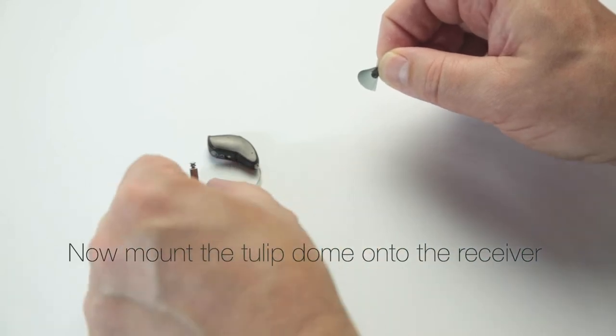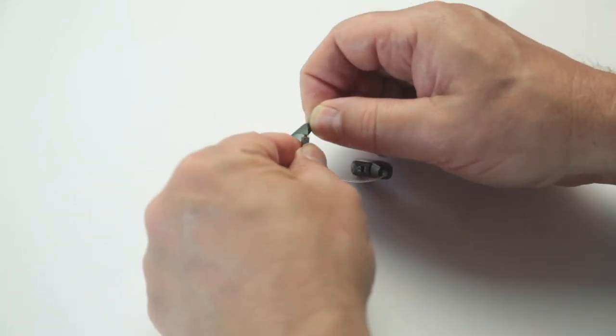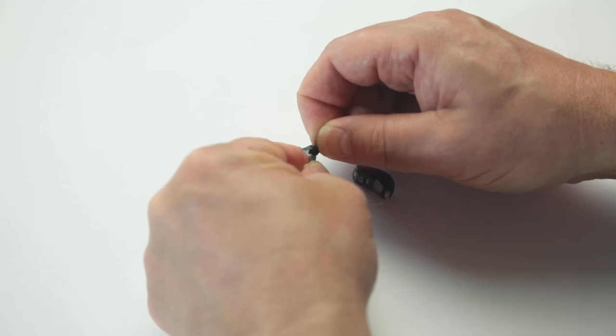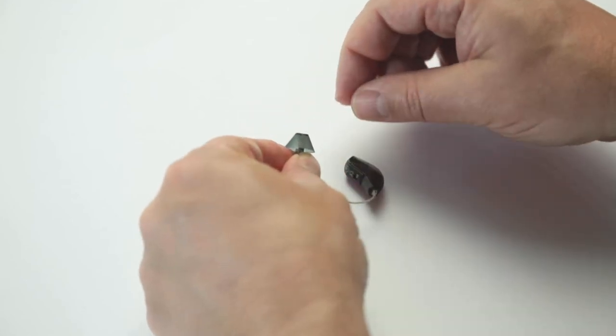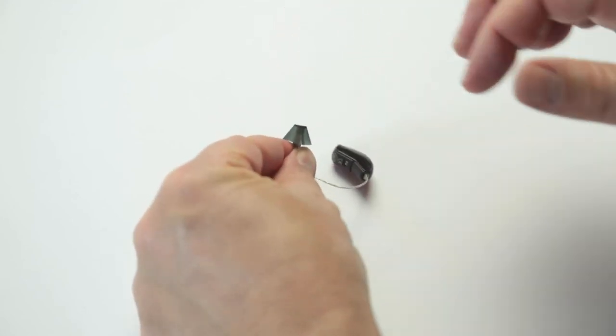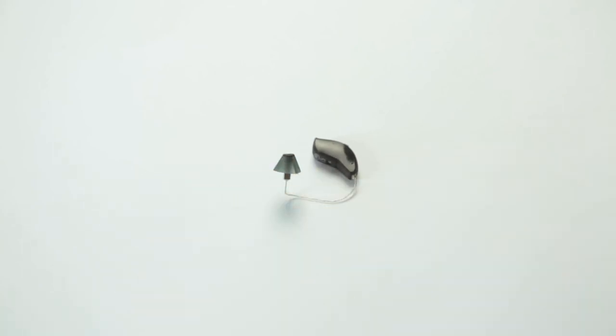Now mount the tulip dome onto the receiver. Once you've confirmed the tulip dome is firmly attached to the hearing aid receiver, gently fold back the petal into place.